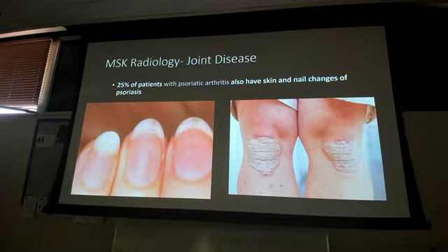Questions on psoriatic arthritis? I'm distinguishing it against any of the other ones we talked about, because that's where this gets challenging, remembering one of those little nuances for each arthritis, both from a picture standpoint, a radiograph standpoint, but then also a patient presentation standpoint.